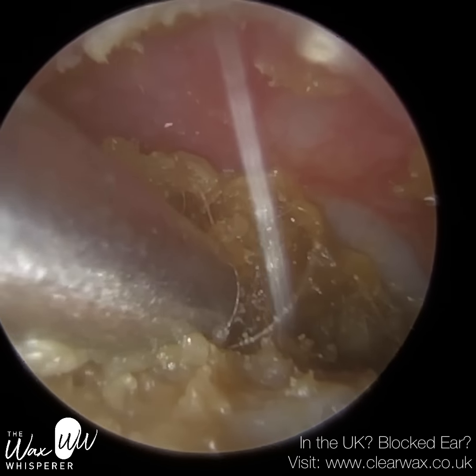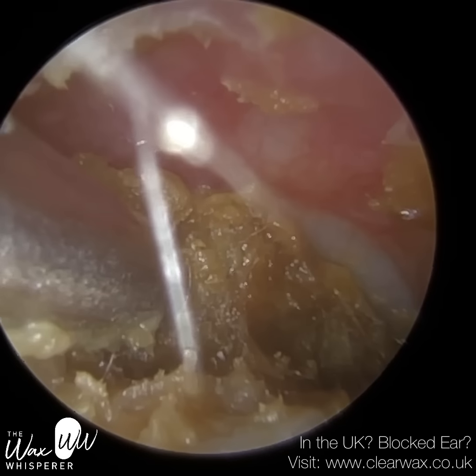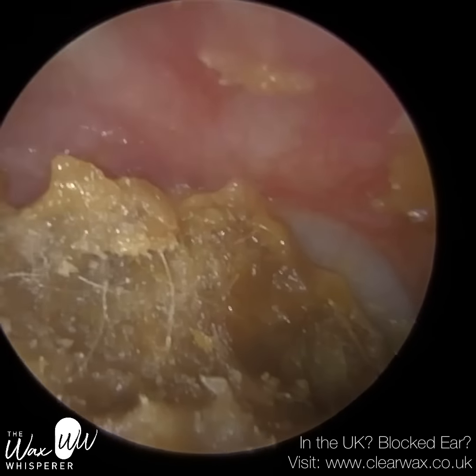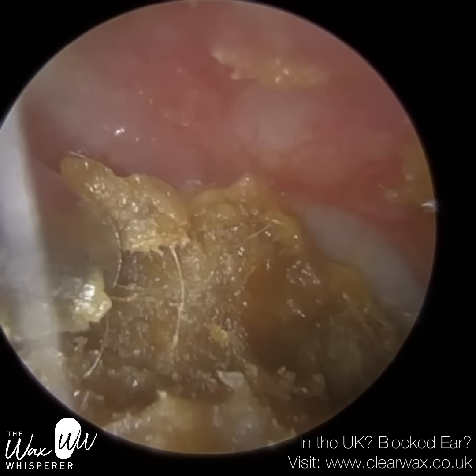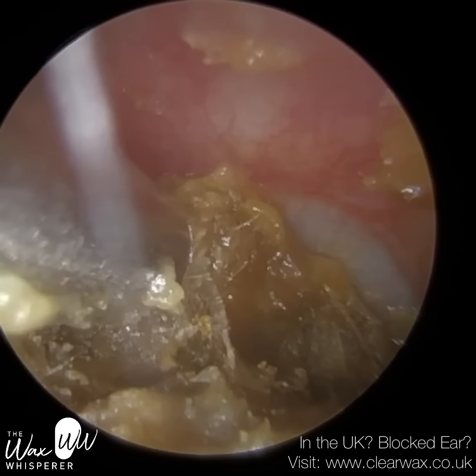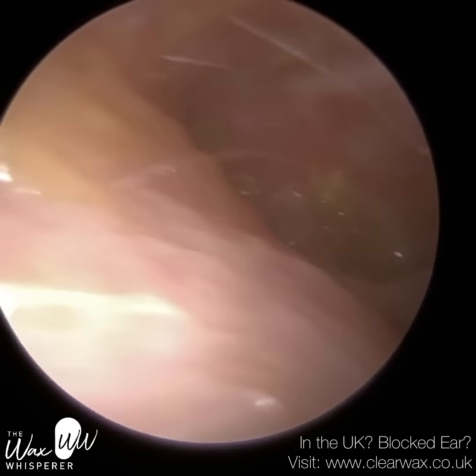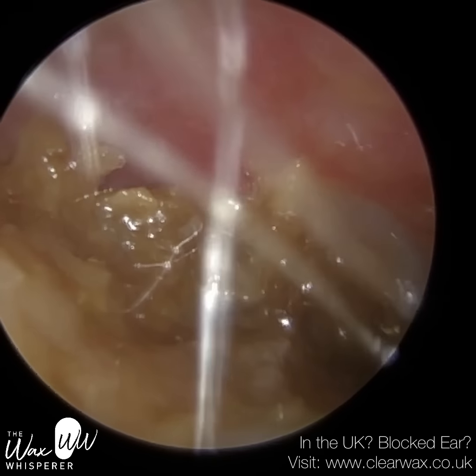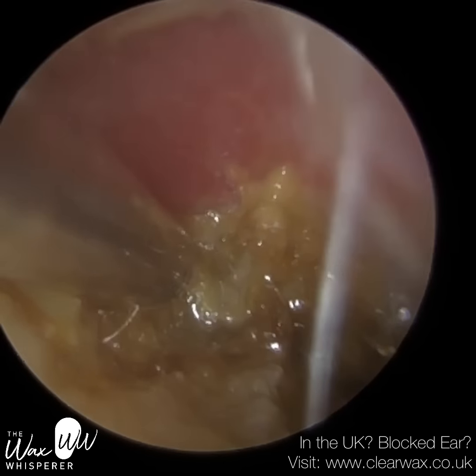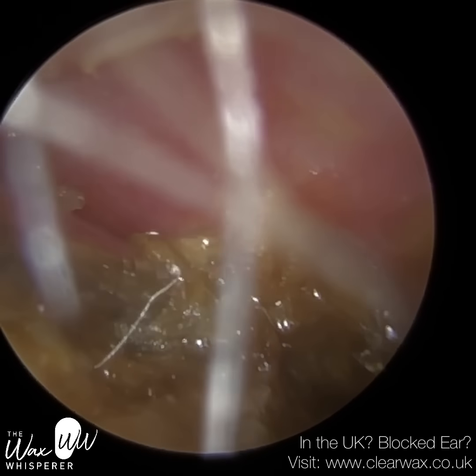I can then go in with the suction probe. You can see even with the suction probe here it's not suctioning too well — it's almost squashing this wax and dead skin together. We don't want to further impact it against the eardrum. You can just see that mushy consistency. So I'm going to go back in with some more oil — just soaking it. A new technique I'm using more and more in the last year or so is actually performing the procedure with the oil in situ.